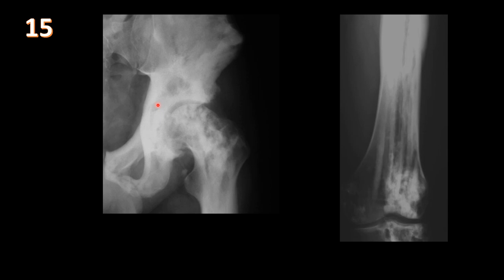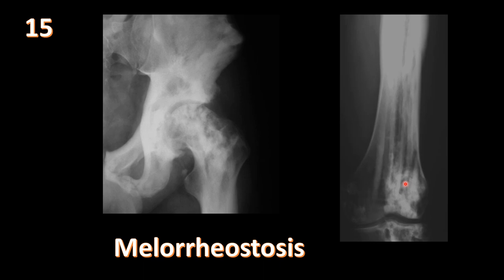AP views of the hip and femur show increased sclerosis throughout the left hemipelvis, proximal femur, femoral head, femoral neck, trochanters, and distal femur, with a candle-wax dripping configuration along the cortex. This is melorheostosis — nothing else looks quite like it. Key features: candle-wax dripping appearance, usually unilateral, occurring in a dermatomal distribution.